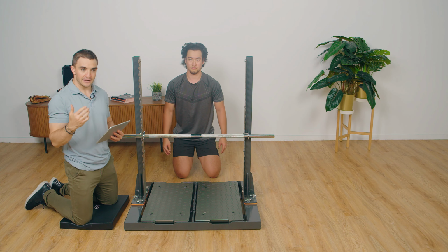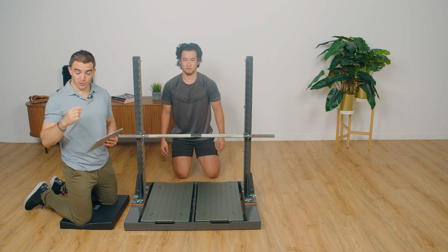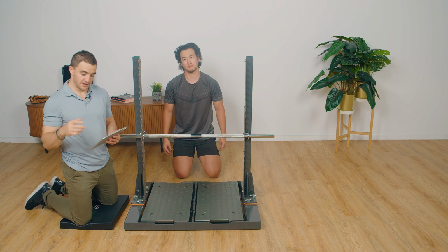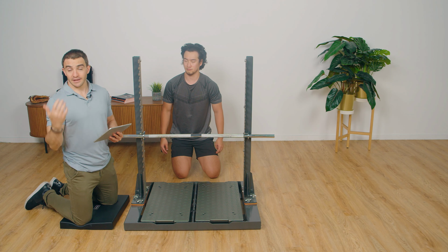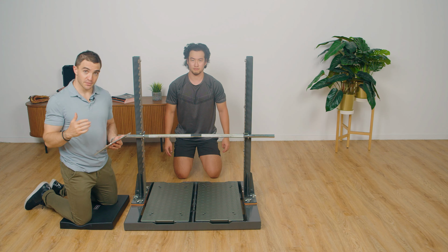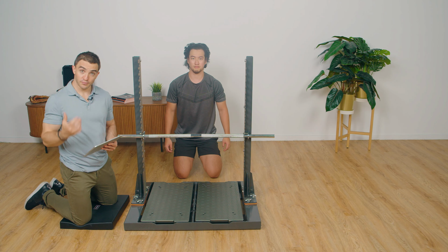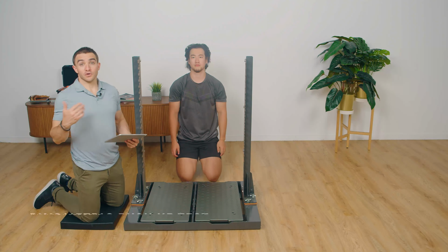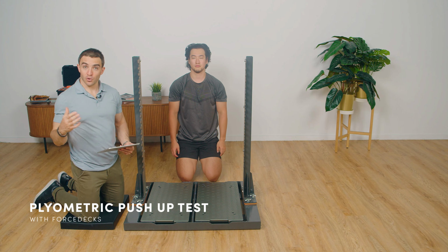So what we're really looking at is how long does it take him to produce the bulk of his maximal force potential? And the last thing we'll look at is RFD at around 150 milliseconds. And again, this depends on the cue. Just like all our other isometric testing, we can cue for peak force, rate of force development, or a combination of the two. So once we've looked at the push-up pattern, we're okay with the quality of the movement.